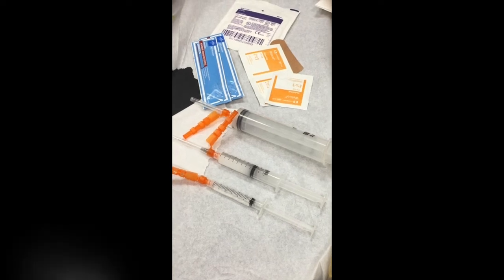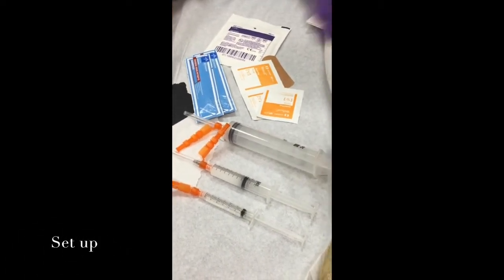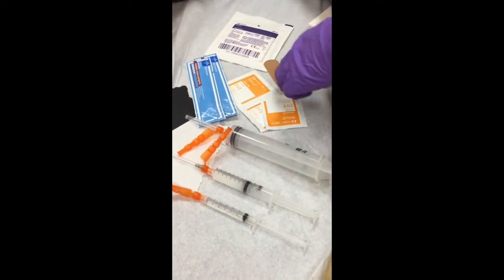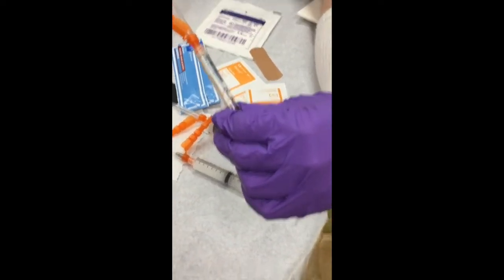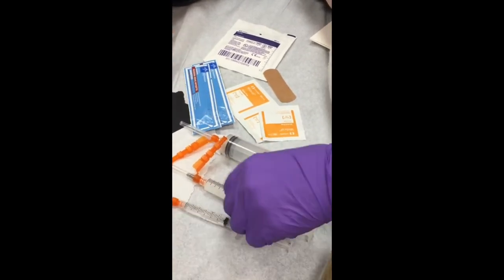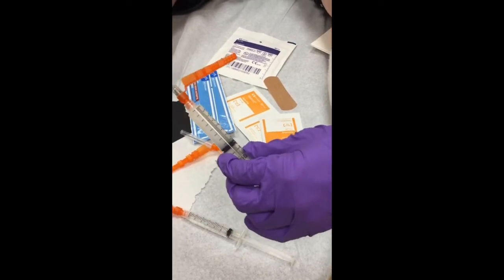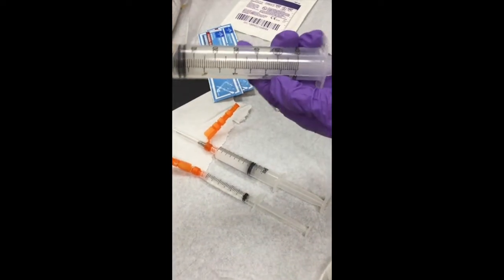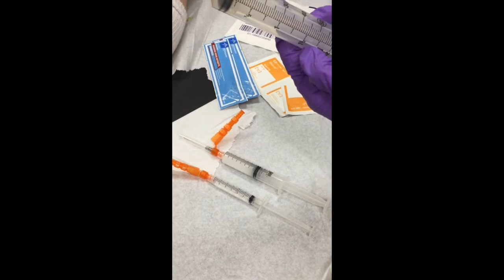We're going to perform a standard knee aspiration cortisone injection. We have all our items set up on a table: two sticks of standard betadine, a couple of alcohol pads, gauze to wipe off, and a band-aid. We've drawn up a few cc's of 1% lidocaine as a superficial local anesthetic on a 25-gauge needle. For the cortisone injection, we use 6 cc's of 0.25% Marcaine mixed with 40 milligrams of Kenalog, and a 60 cc syringe loaded with an 18-gauge needle.